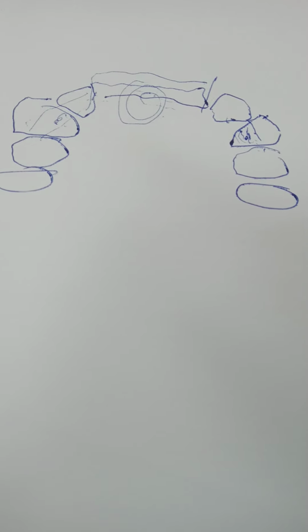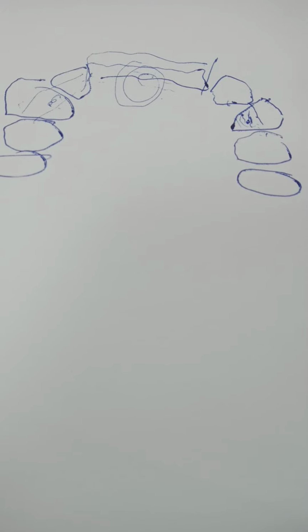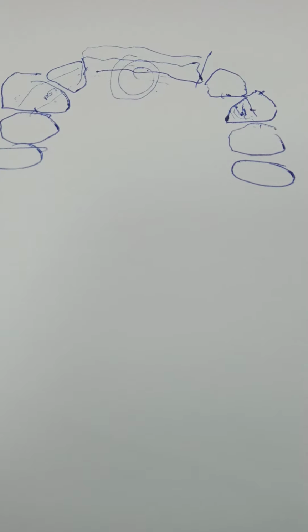And most probably it was flabby because of the previous periodontal disease, and it's knife edge, and the slopes are acute. So how am I going to utilize it for support? It will not give me the support and the stability I need for indirect retention. Okay, so I go back to the rest option there. I need to place the rest here and the rest here.